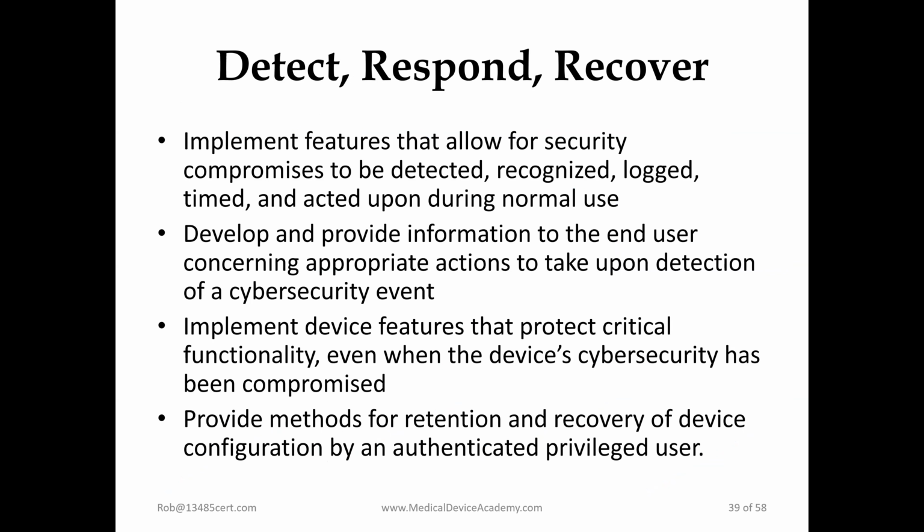So detect, respond, and recover are the elements of cybersecurity for when security is compromised, so that you can detect whether or not there has been a threat exercised, and you can be aware that that has happened so that you can respond.